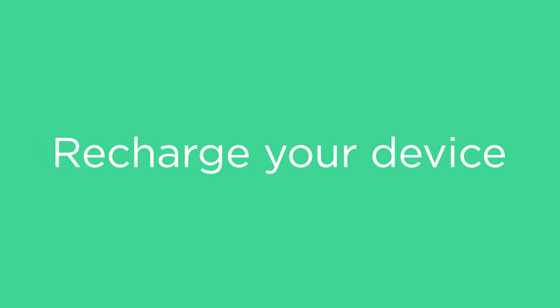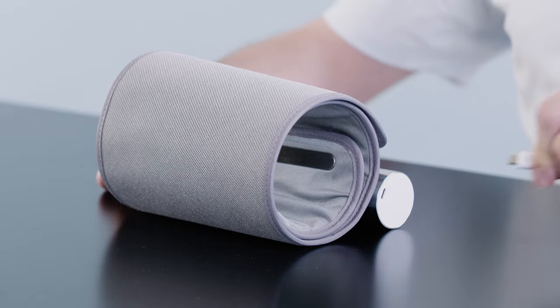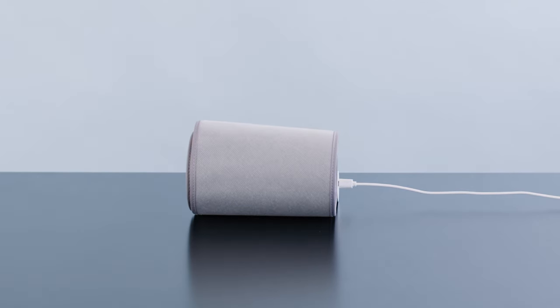Now let's see how to recharge the device. BPM Core is rechargeable via micro USB. Simply plug it in with the provided cable and charge it for approximately three hours. BPM Core lasts up to six months with one charge. We hope you enjoyed getting to know BPM Core.